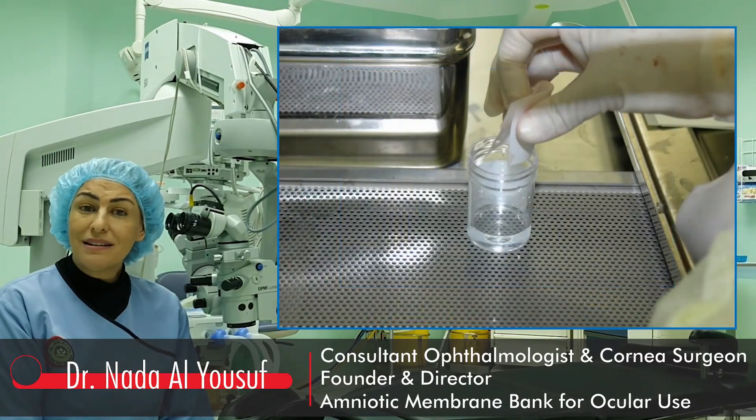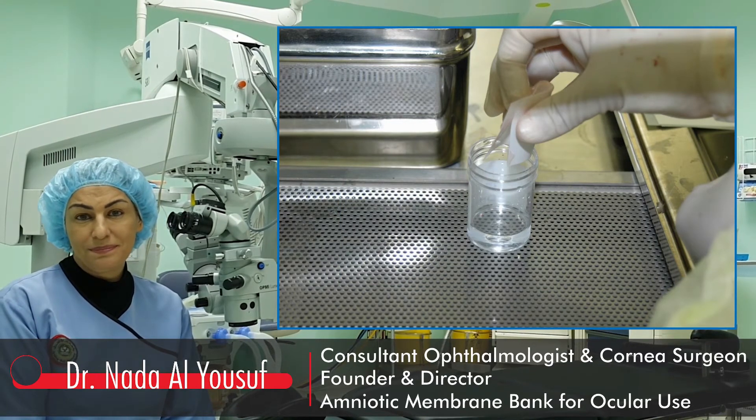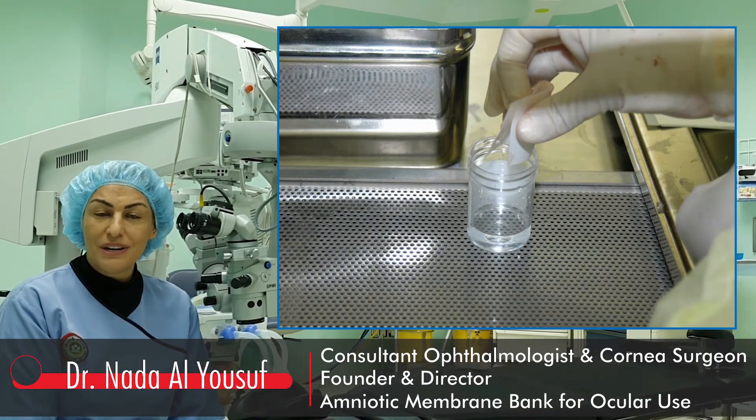The pieces are then placed into sterile vials containing DMSO 10% medium. The vials are stored at minus 80 degrees centigrade.